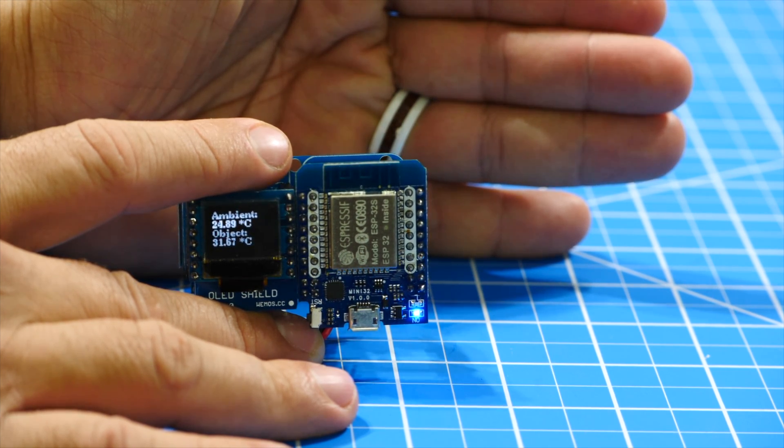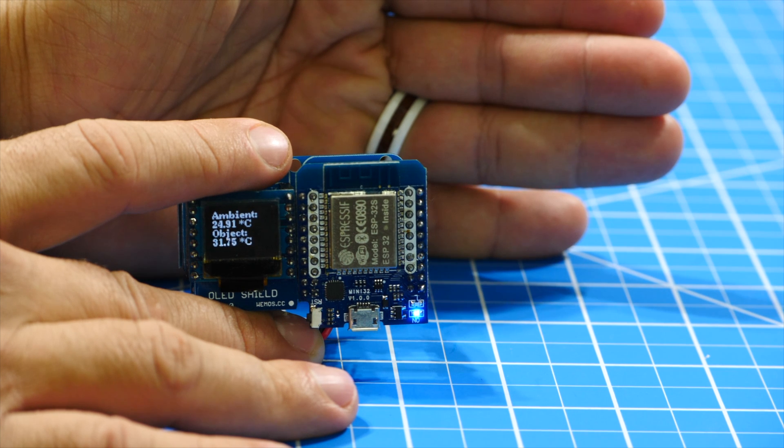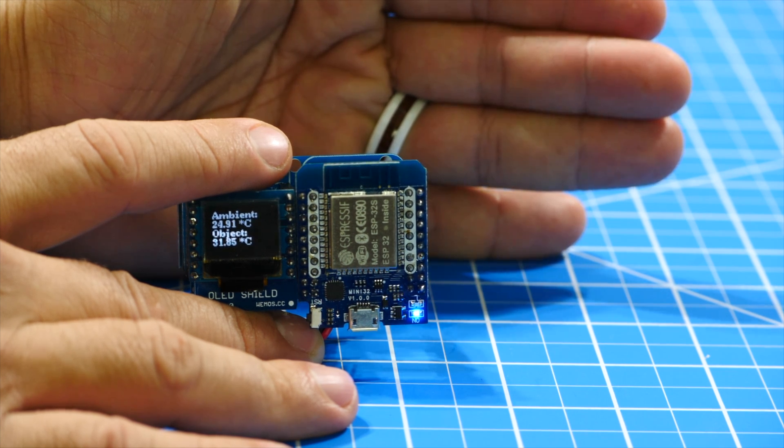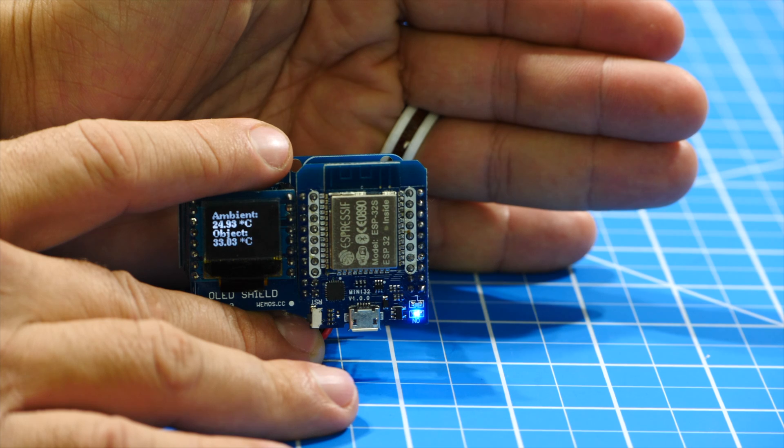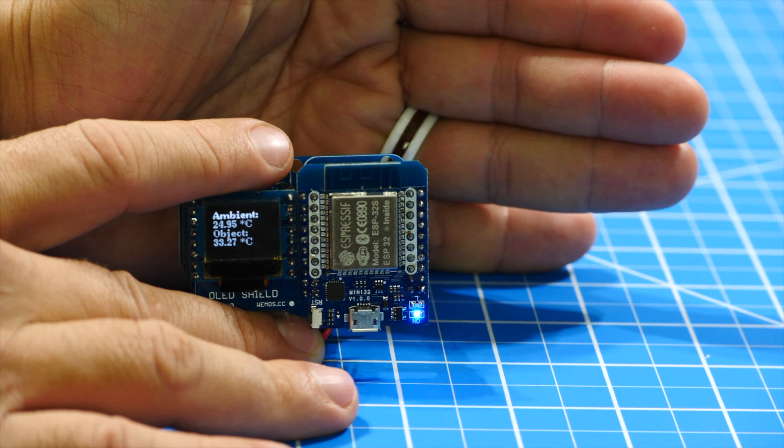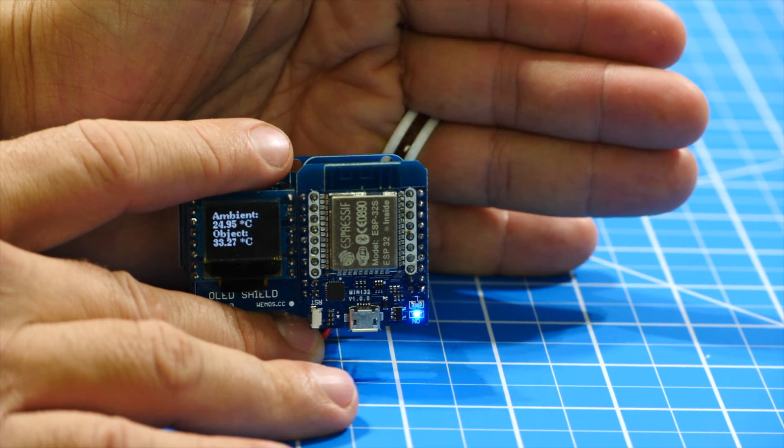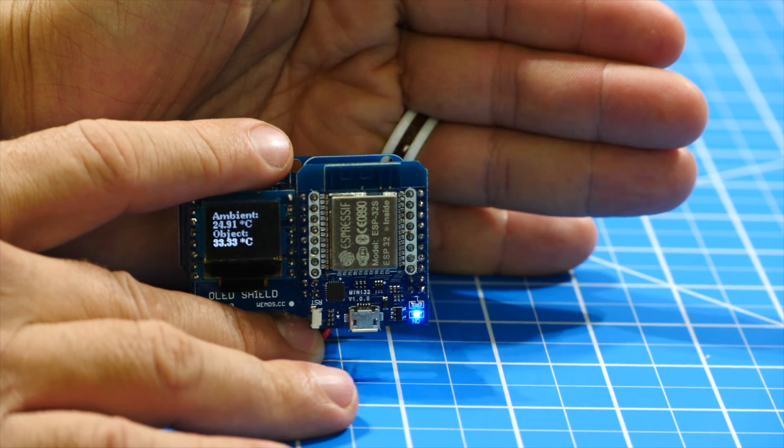But there you have it. Really quickly, we've used the Melexis 90614 sensor and an ESP32 to build a contactless thermometer.